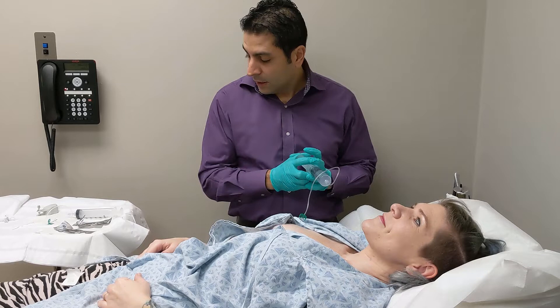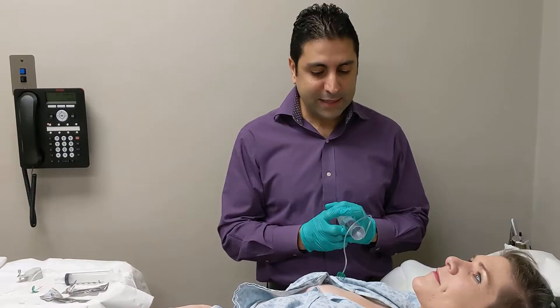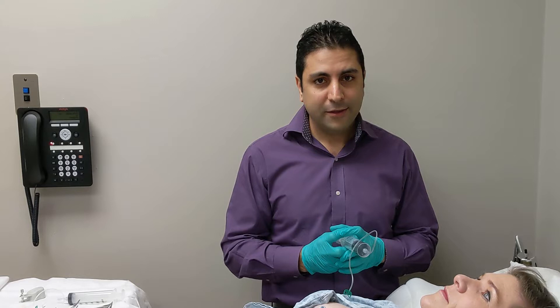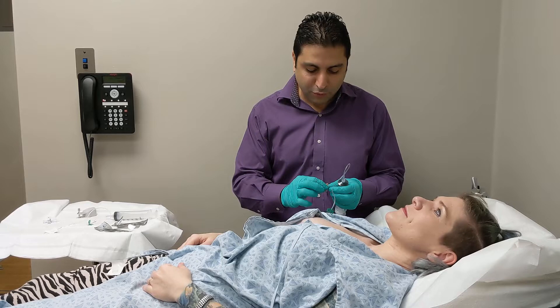The advantage of doing these expanders is that it allows us to develop a breast shape that we like. This is not the permanent implant. She mentioned feeling some pokiness, and she asked if that's the expander — and the answer is yes. These expanders are hard; they're not intended to feel like a real breast. Their job is to push and expand the skin. People always say these things are so hard, and I always say that's exactly what they're supposed to be, because they're supposed to pull on your skin and try to recruit skin.